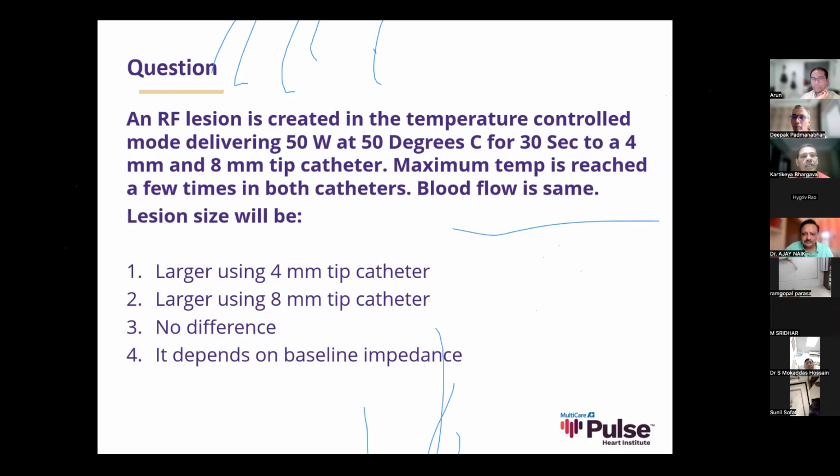So first, there is another problem with the 8 millimeter catheter. The larger your catheter tip is, the lesser is your resolution, so mapping becomes a problem. We use the same catheter for mapping and ablation. So the larger your catheter tip is, the lesser is your resolution.